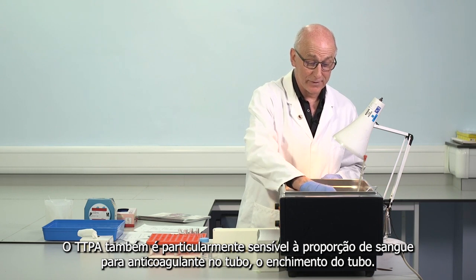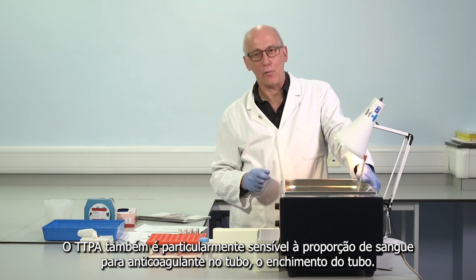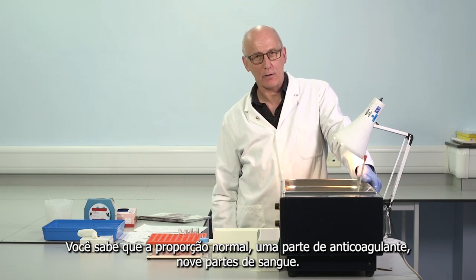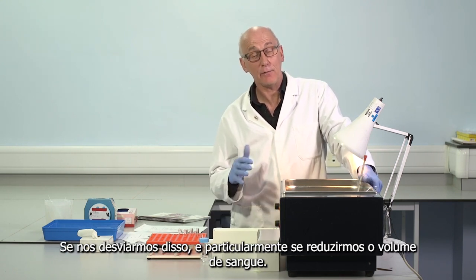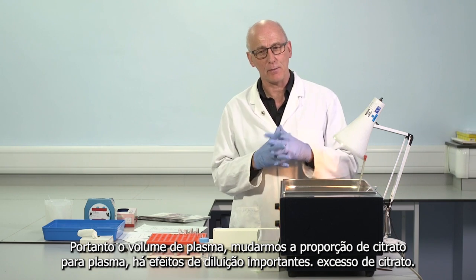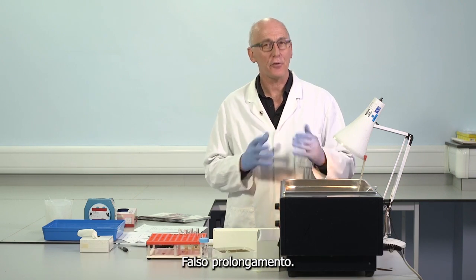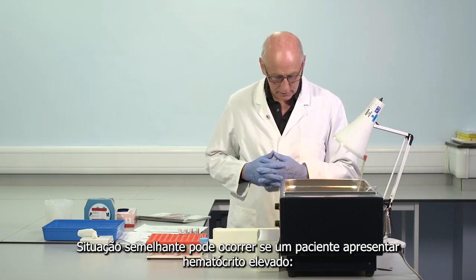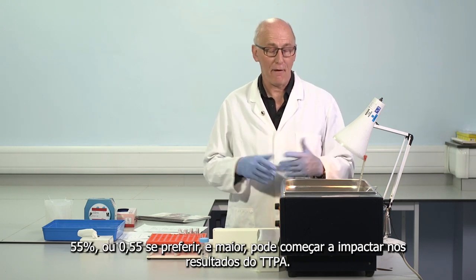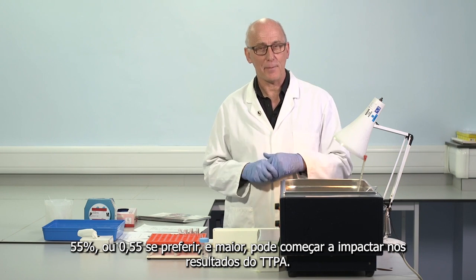The APTT is also particularly sensitive to the ratio of blood to anticoagulant in the tube, the filling of the tube. You know the normal ratio, 1 part anticoagulant, 9 parts blood. If we deviate from that, and particularly if we reduce the volume of blood, therefore the volume of plasma, and change the ratio of citrate to plasma, there are important dilution effects, citrate excess, false prolongation. A similar situation can occur if a patient has an elevated hematocrit, 55 or 0.55 if you prefer, and higher, which can start to have an impact on results of APTT.